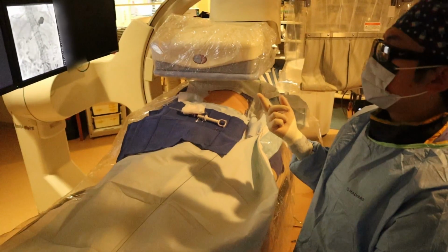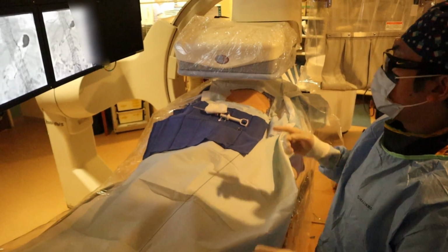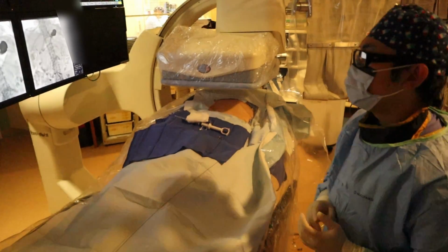As you can see, we're insufflating the stomach. It's getting larger, distended, and not a lot is passing through the pylorus, right? So this will be a good window. We'll assess the window on AP first, and then we'll do some angulations during the case. Doing great, keep going.